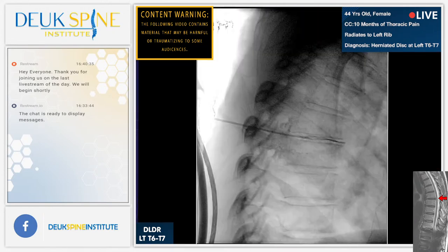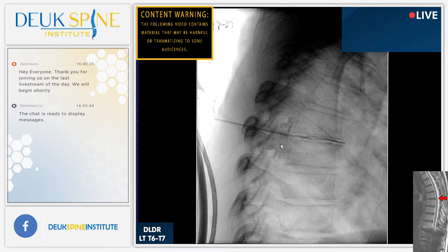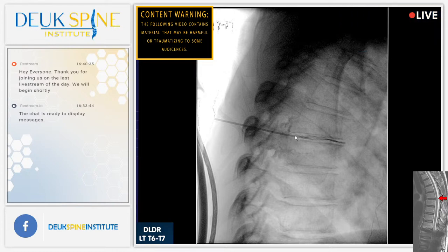All right. So let's see that tear. You can see a tear in the front. That's not causing her pain. And you can see a tear in the back, but the needle is overshadowing it. But there's dye now in the epidural space. Yep, and that dye got there through a tear in the back. So there must be a tear in the back of the disc.